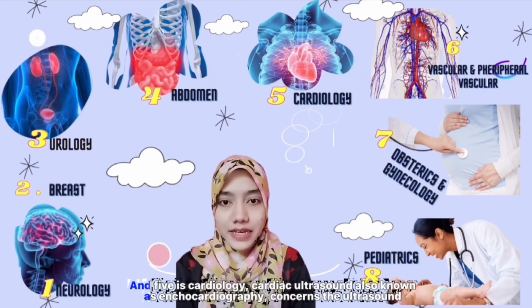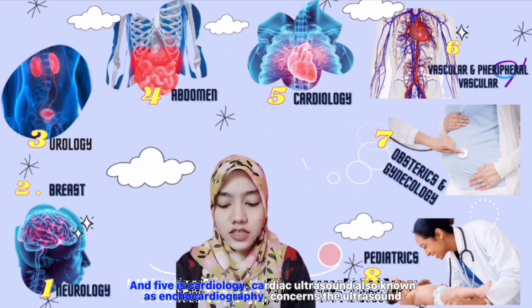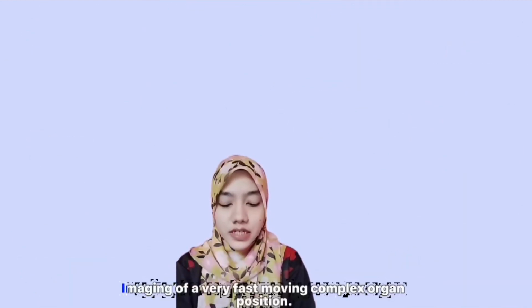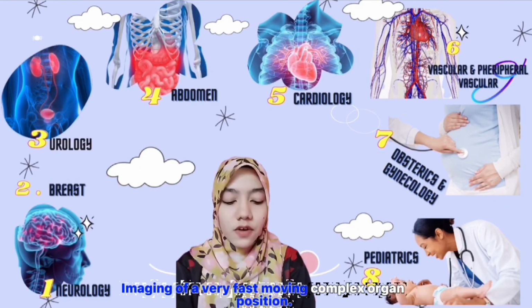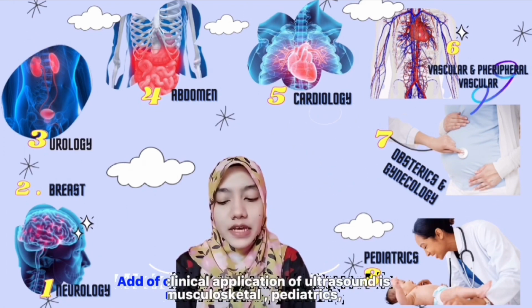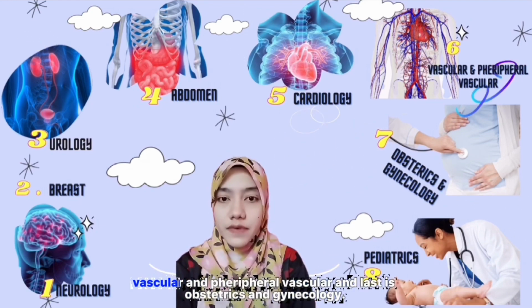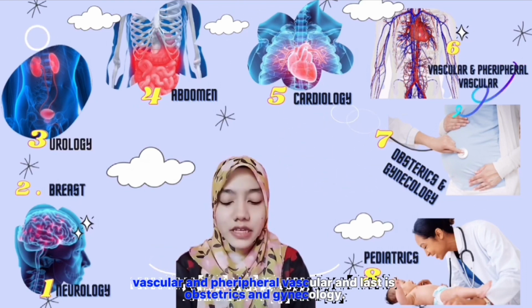And 5 is cardiology. Cardiac ultrasound, also known as echocardiography, concerns the ultrasound imaging of a very fast moving, complex organ. The end of the clinical applications are musculoskeletal, pediatrics, vascular and peripheral vascular, and the last one is obstetrics and gynecology.